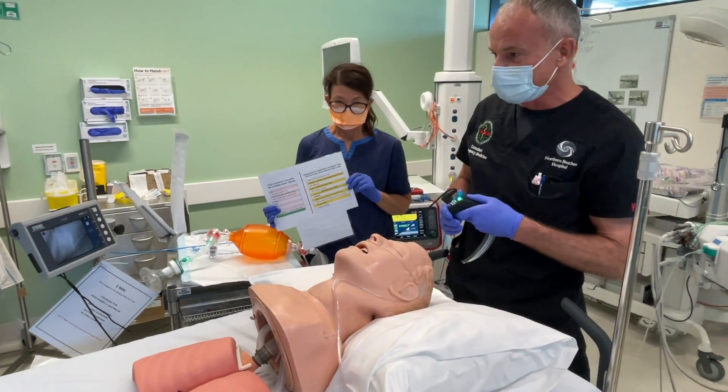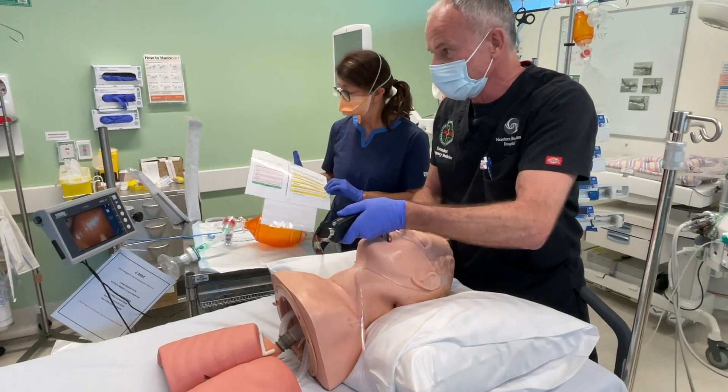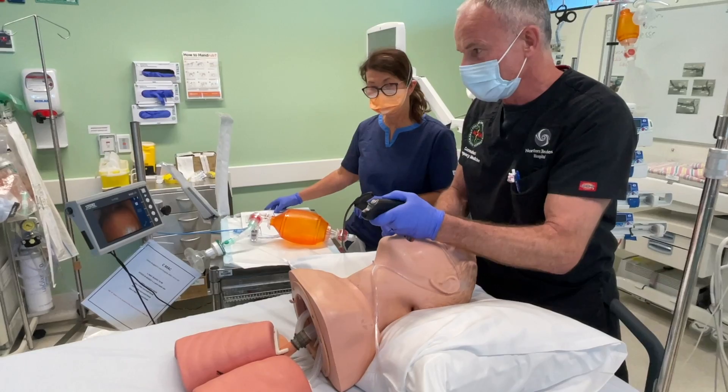We're going to go through the sequence to optimise the laryngeal view. If we're doing laryngoscopy and we don't have a perfect view, we don't have an adequate view, then there are a few things we can try.